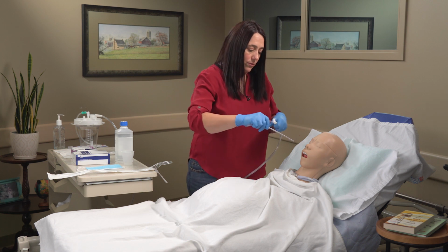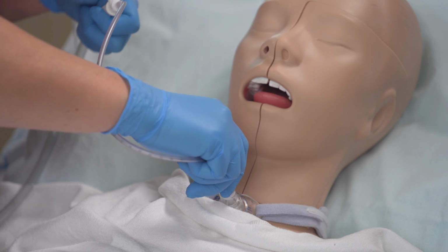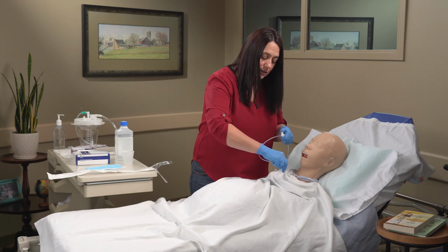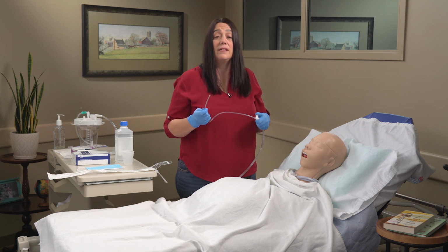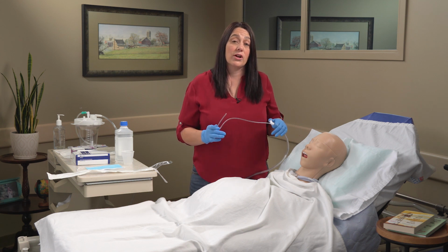Okay, so we're going to put it in there, going no further than 6 inches, covering the hole and slowly twisting over no more than 10 seconds as I'm pulling out of the person. Then I'm going to see how they're doing. I'm going to give them at least a 30-second breather. After that 30 seconds, I can have them try to cough during that process too to see if they can get the rest out. If their SATs remain high and where I want them to be, then I'm not going to go back in and suction that person again.